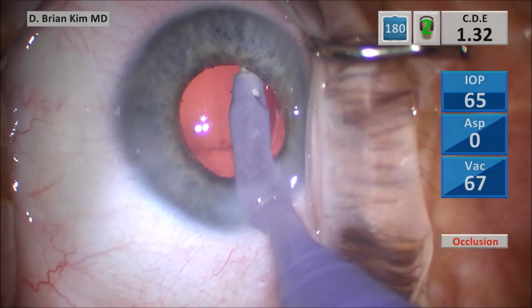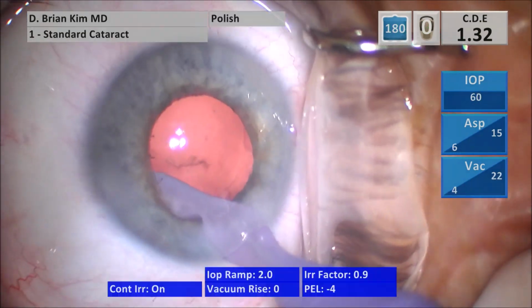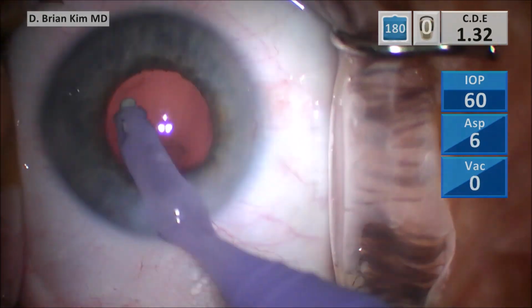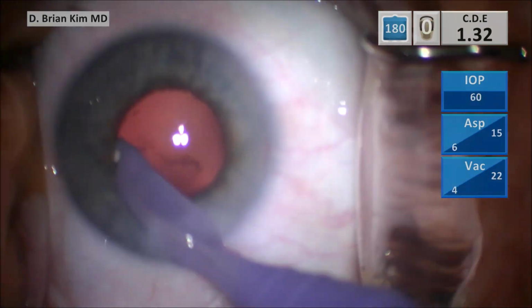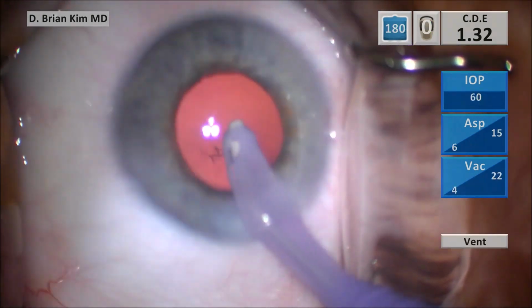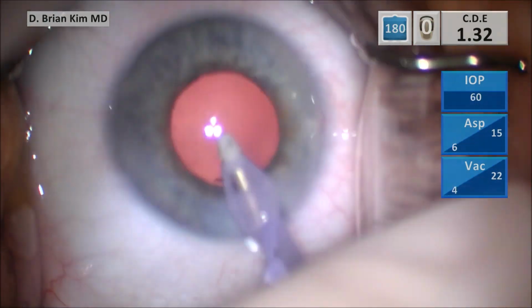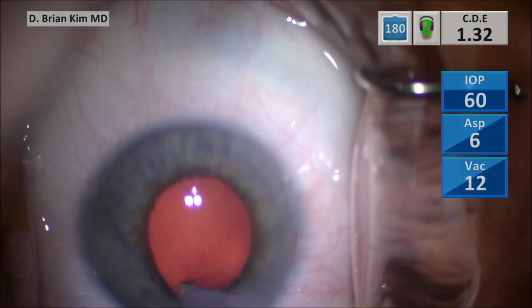You can see this is a fairly clean bag now, and I switch to the polish mode to get underneath the anterior capsule edge to remove any cortical material, lens epithelial cells. Again, I do this when there's a smaller size pupil. I'm now removing the lens material from the posterior capsular surface. You can see the polymer tip was able to sweep off and remove that material very easily with that polish mode in place.